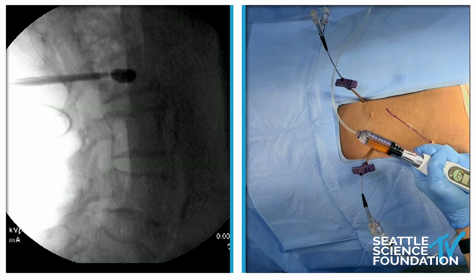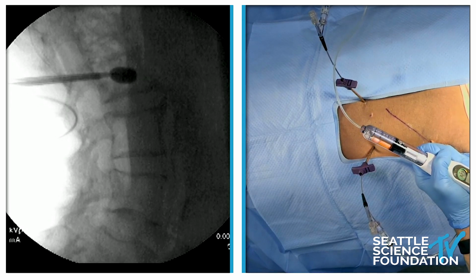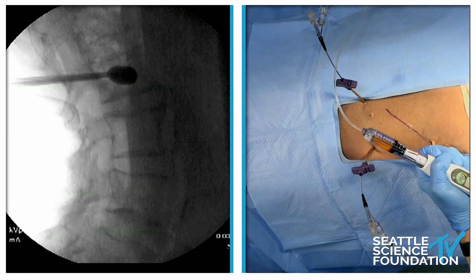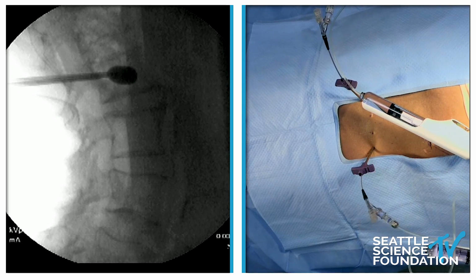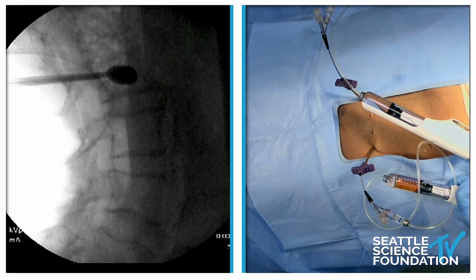way. So as the balloon reduces the fracture, or the expansion device like SpineJack reduces the fracture, it will be painful because you're moving the fracture fragments, you're moving the periosteum. So if you have it anesthetized, you'll be able to do this as an office-based procedure without general anesthesia. If you don't have it anesthetized, the patient will be uncomfortable.